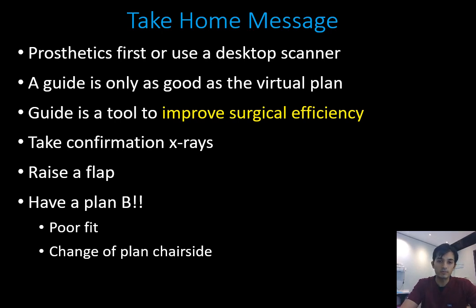But sometimes the guide may not fit, and you want to be able to do this case without the guide if it comes to it, or if you drop your guide on the floor for that matter and don't have a spare. You should be able to finish that case free-handed. Don't rely on the guide to be able to do the case with it.